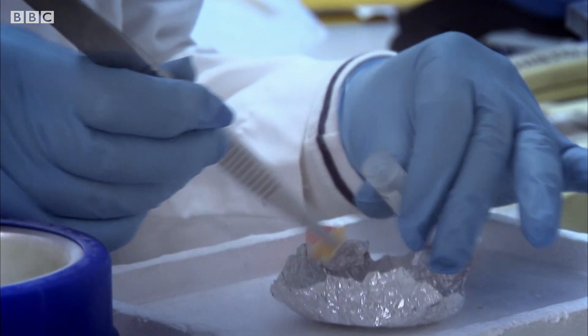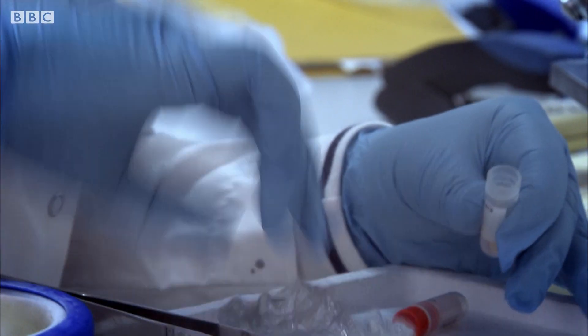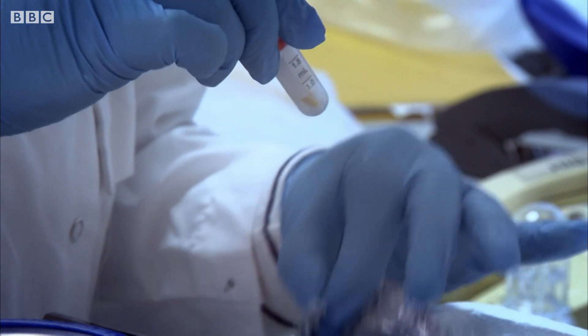Thankfully, this patient didn't have a tumour. But more often than not, Louise receives samples which do contain cancerous tissue. Yesterday there was a case — a specimen from a lady with breast cancer. The yellow is the background fatty tissue, and the tumour is clearly visible: a very pale, round tumour.